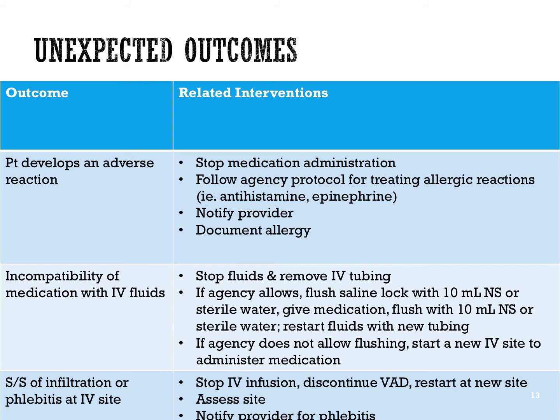If your patient has signs and symptoms of infiltration or phlebitis, when we go over IV starts, we'll talk about infiltration and phlebitis in more detail. But with infiltration, the IV catheter has actually moved out of the blood vessel and it's in the tissues.